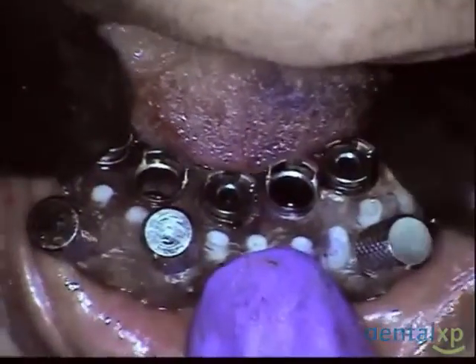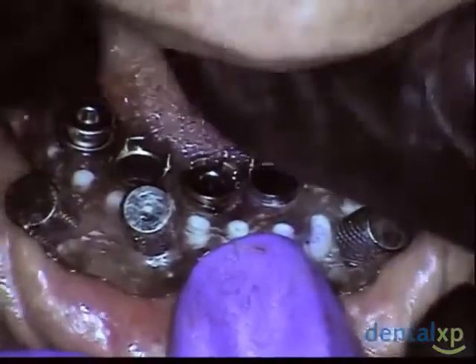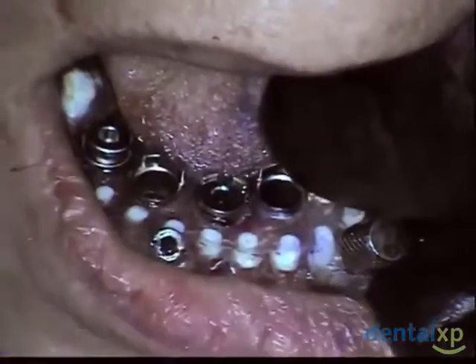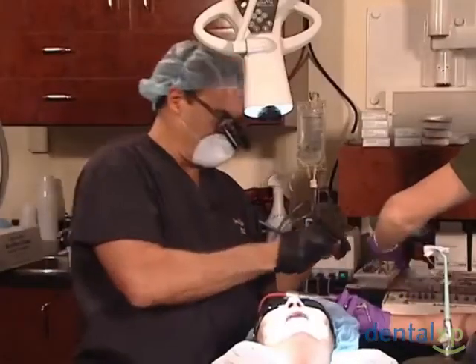All right, so now we're going to go with our 1.6. Let's take it out one more time. It's important that you make sure those are locked in place. If they aren't, what will happen is that your inserts will move on you when you start your burr.